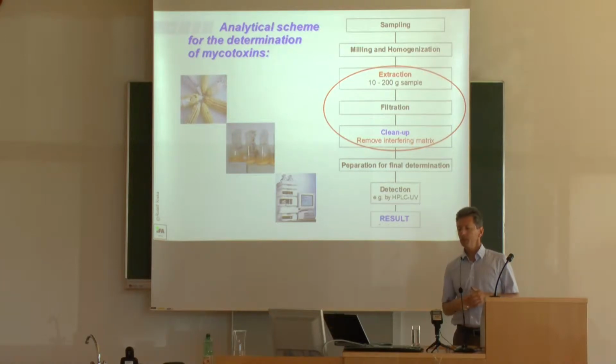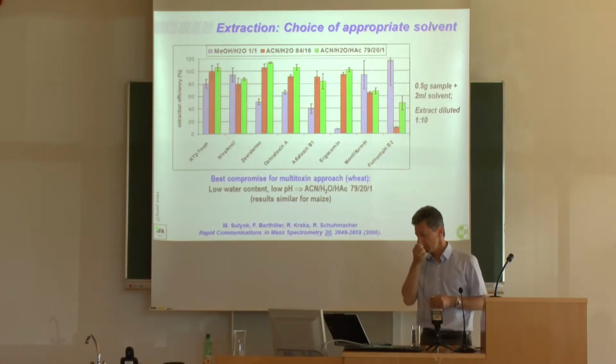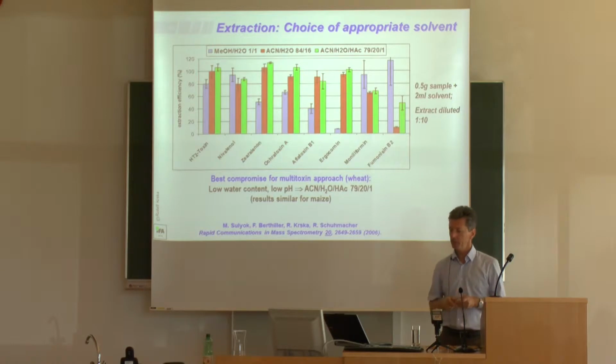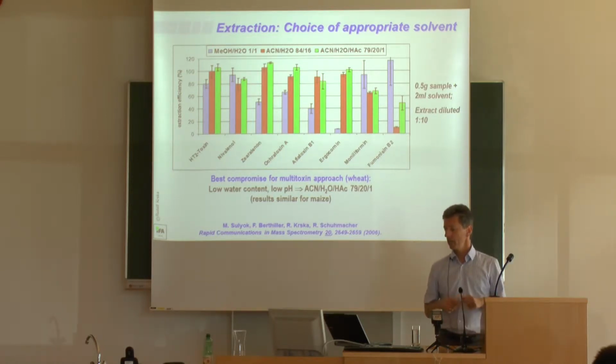The next step after proper sampling and homogenization in the analytical scheme for determination of mycotoxins is extraction, filtration, and cleanup. And that is what I will dwell on in the next 15 minutes or so, I guess. Let's talk about extraction first.